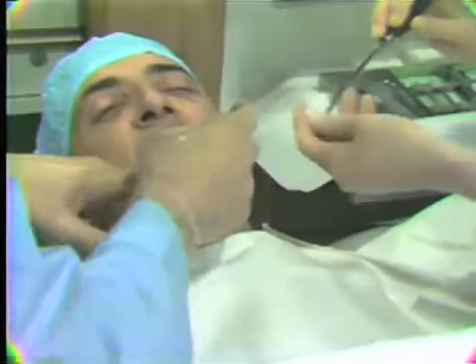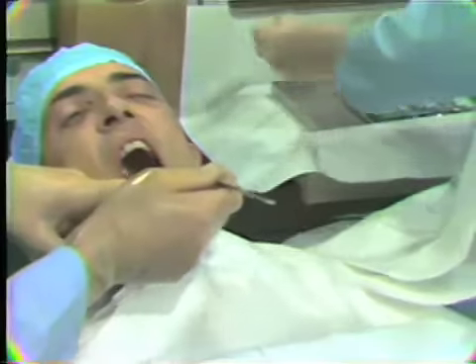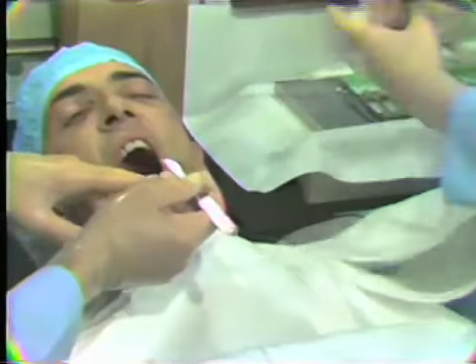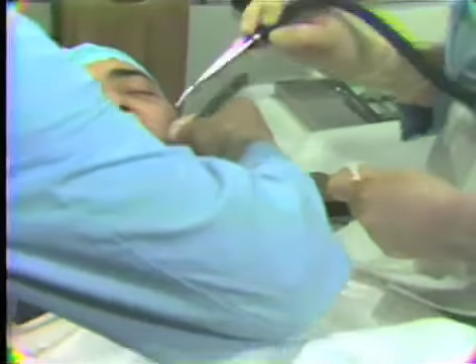Now, can you open wide for us, please? I'll need the scalpel again. Again, we move back slightly and transfer the scalpel and the mirror also. If you'll open wide for me, please.